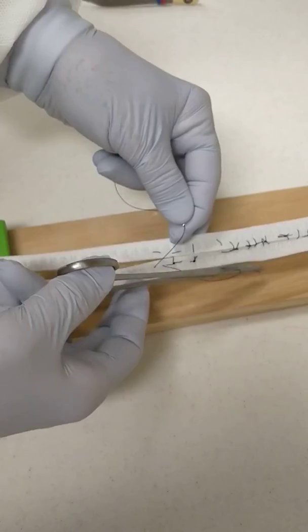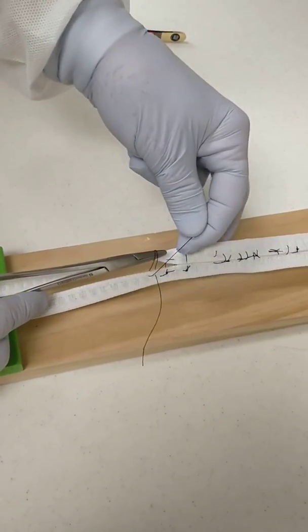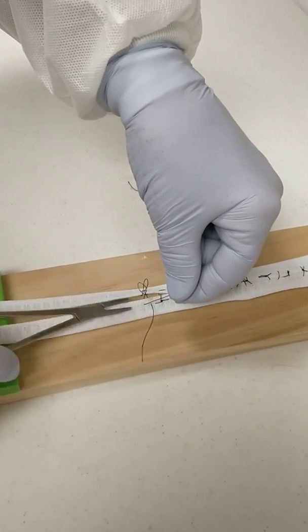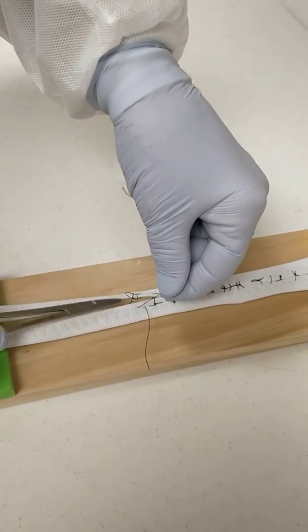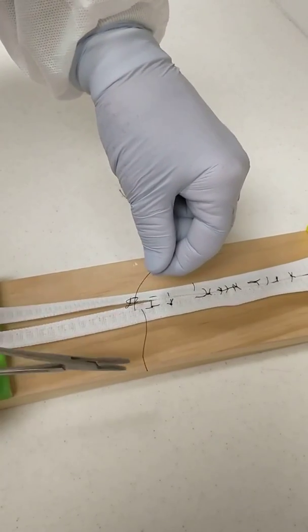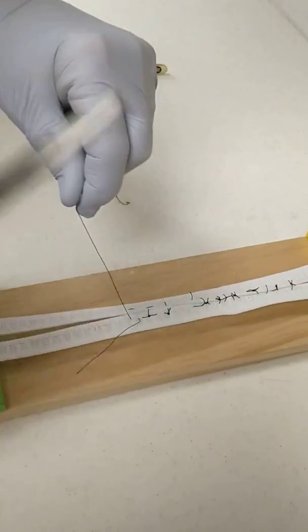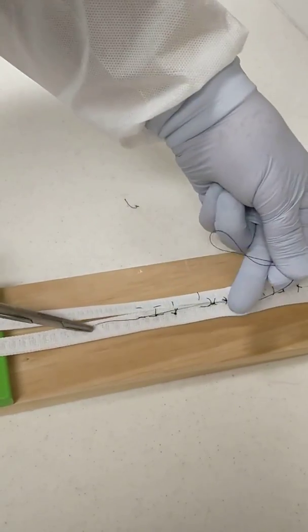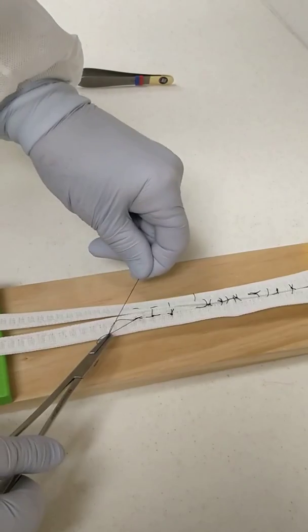Often, if we have a graft, you'll take an instrument, place it under the suture, and pull it up. Put your graft material into the socket. Put your membrane over that. And then you can pull it tight. And that crisscross helps hold the membrane in place so that you don't lose your graft material.